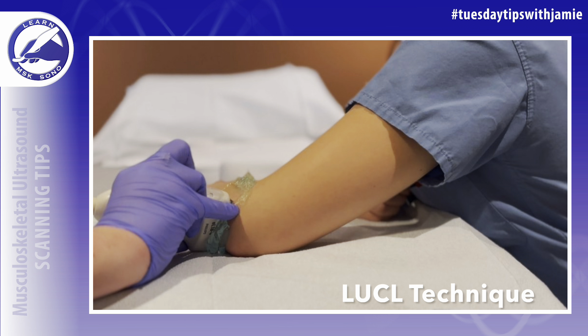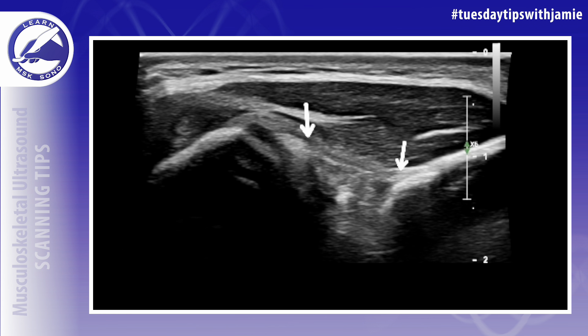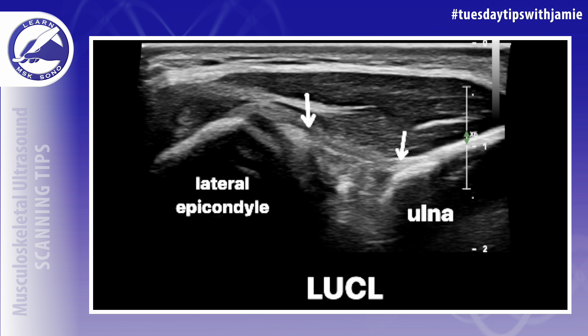After you've located the common extensor tendon, keep the proximal side of your probe fixed on the lateral epicondyle and then rotate the distal part of your probe posteriorly until the ulna comes into view. The LUCL can be seen as a hypoechoic band extending between the lateral epicondyle and the supinator crest of the ulna in the ultrasound image.